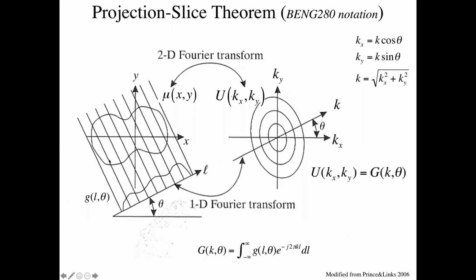Okay, so here's the image of the patient that we desire, the true image, and you can see this is just stolen from the CT lecture, right? In nuclear medicine, this is activity or number of counts. So mu in nuclear medicine is just how many counts do I get at XY, right? This could be like, I got 1,000 counts, or photons captured from this point. So it's brightness as a function of position in the plane.